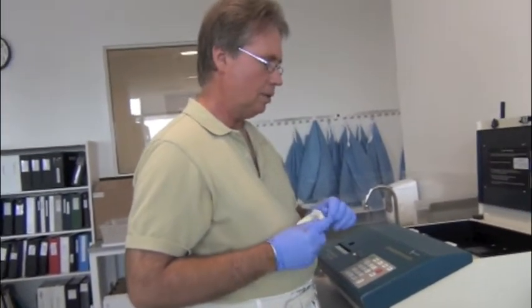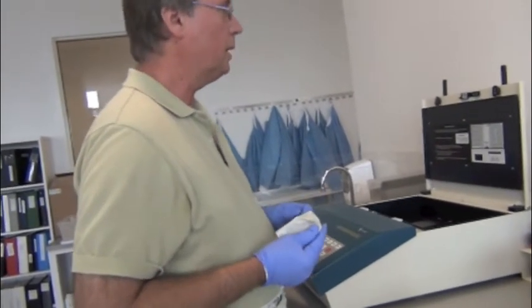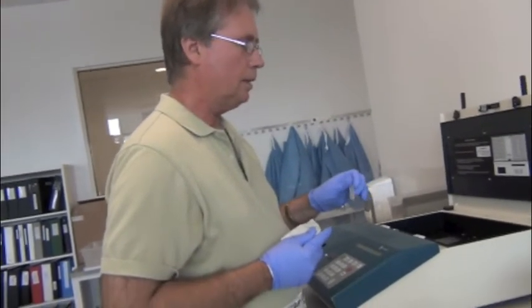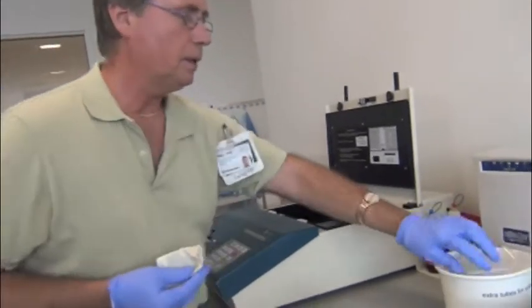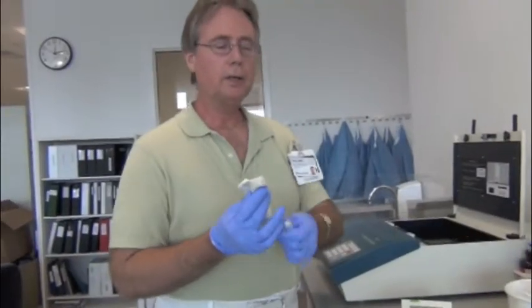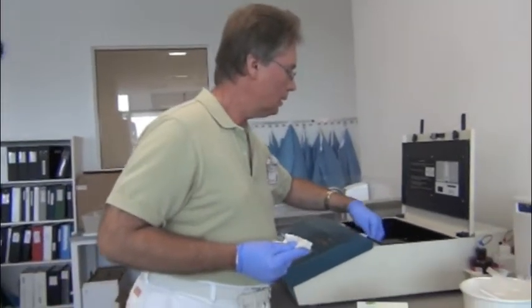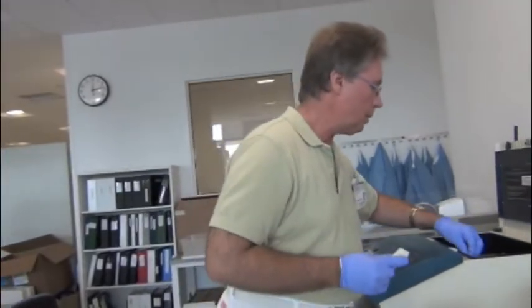This is the GenProbe machine, the luminometer they call it, and we will be reading the results of what we just did upstairs. The yellow tubes for Mycobacterium gordonae we're going to read first. And we have 3 patients.